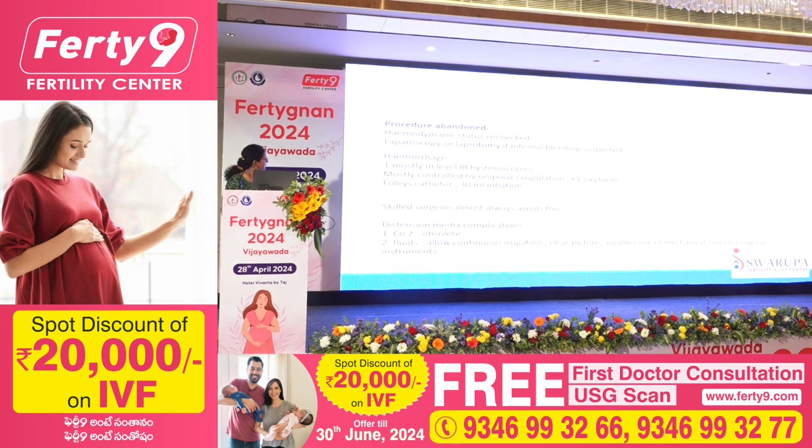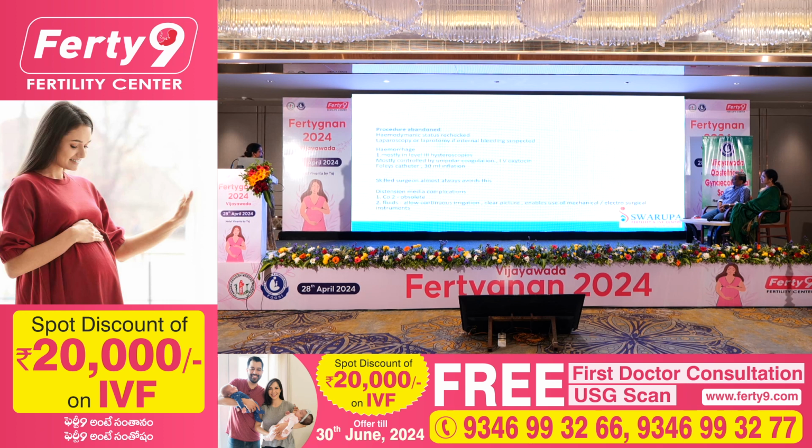When you find a perforation, or suspect a perforation, abandon the procedure and check the hemodynamic status. Don't hesitate to proceed with a laparoscopy or a laparotomy. Always have people with you to counsel when you are doing a surgery, to counsel outside the theatre also.